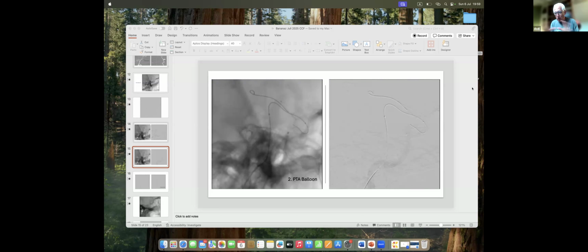When you open a covered stent, you have an immediate result, success, and you say, "Wow." There was this awful fistula, blood everywhere. You open the stent, and wow, everything goes back to normal. That's the only device that gives you this wonderful emotion.